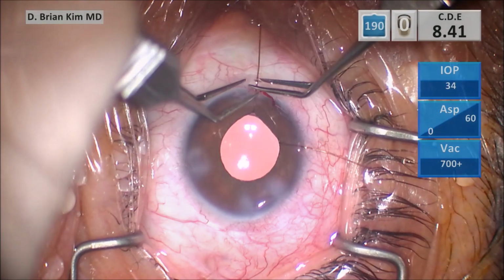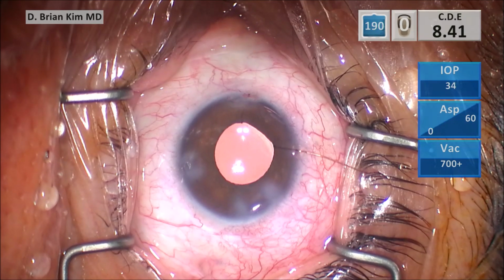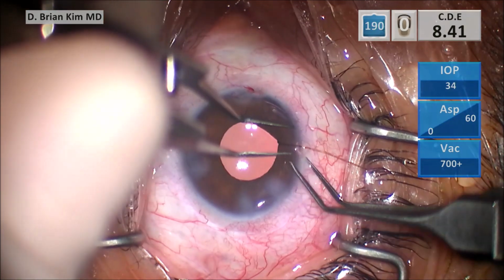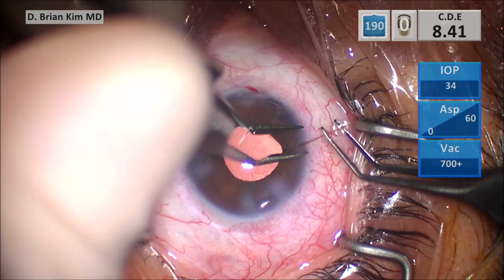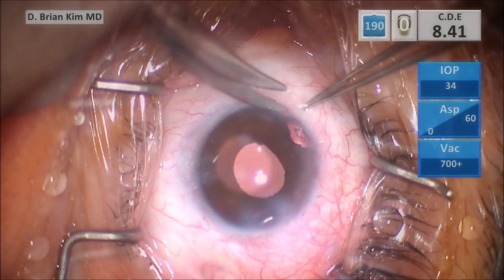Release the stopper, twist, and pop the iris hook off. Again, very easy to do this technique. Again, hold the proximal hook, retract the stopper, pull it down and twist it, and then you can release the iris hook from the pupil. Going to perform a peritomy.